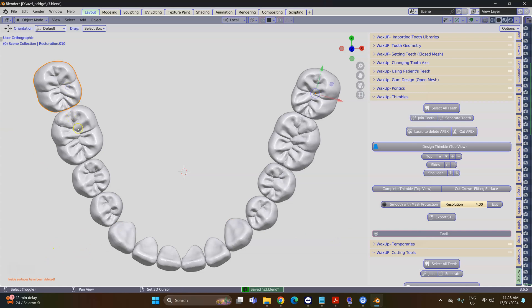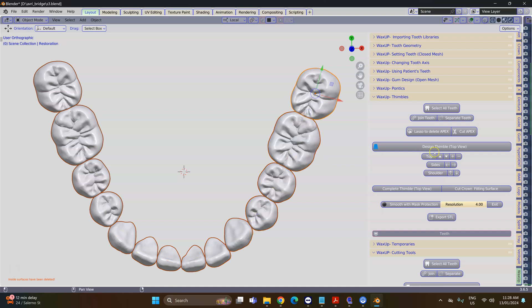I'm going to then select all of my hollow teeth and we're going to then design thimbles from the top view.